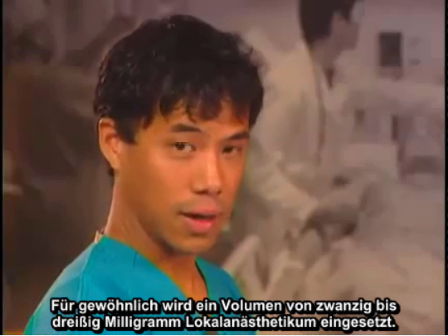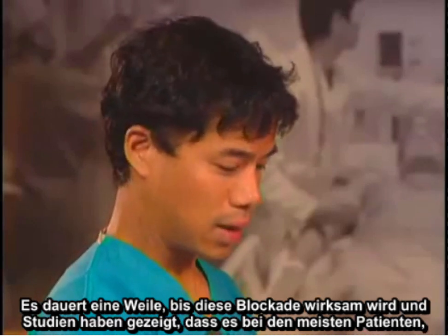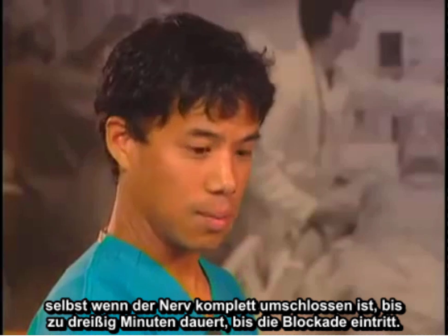Typical volumes used are 20 to 30 milliliters of local anesthetic. This block takes some time to onset, and studies have shown that even with complete surrounding of the nerve, it takes up to 30 minutes for the nerve block to onset in most patients.